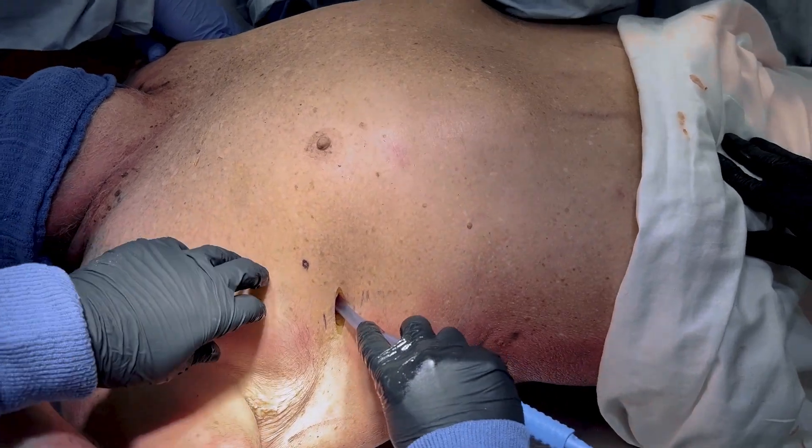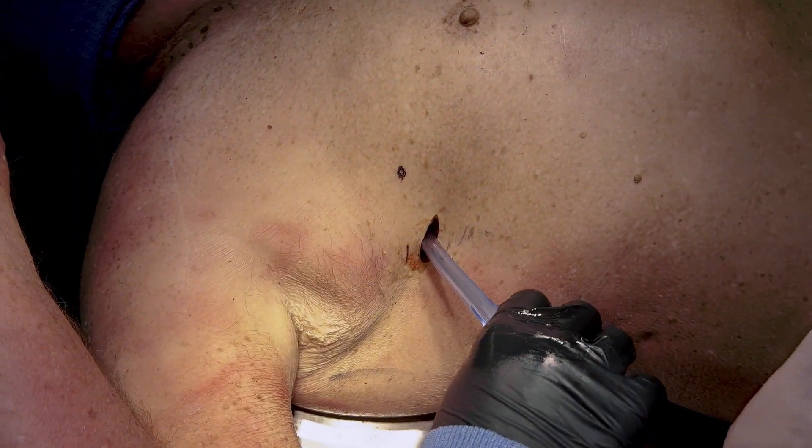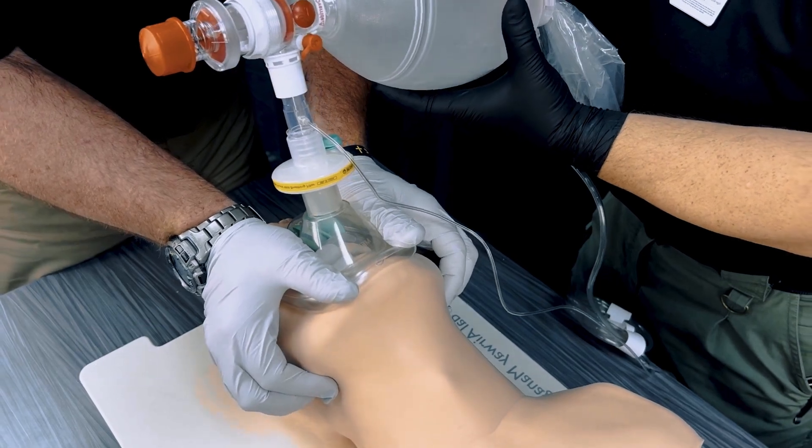In the case of massive hemorrhage through a properly placed finger thoracostomy, place a Ducanto suction catheter just beyond the insertion site. Give positive pressure ventilation and initiate rapid transport to the closest trauma center.